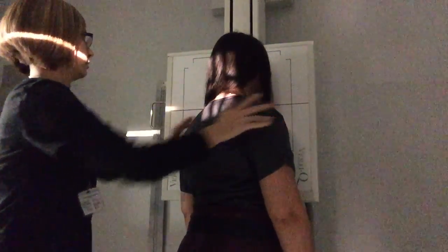In this room we're not able to get a complete 15 degree angle due to space constraints — you may have to adjust in lab, but in clinic you would do 15 degrees. My patient's left side is up against the IR so I'm going to put the left marker on the bucky. Everything is lined up. I'm going to use 85 kVp and the patient will hold her breath.